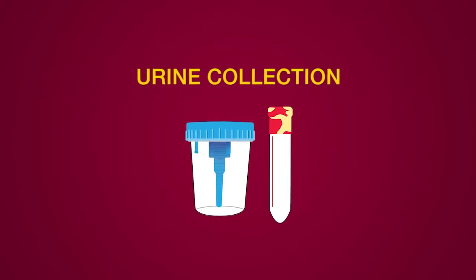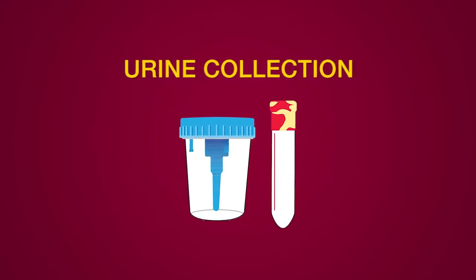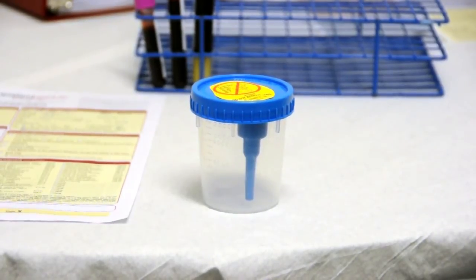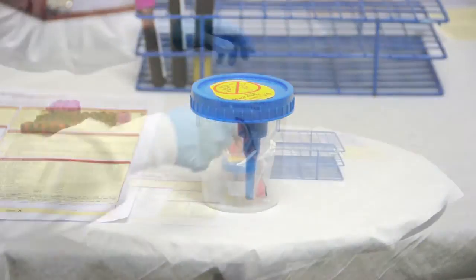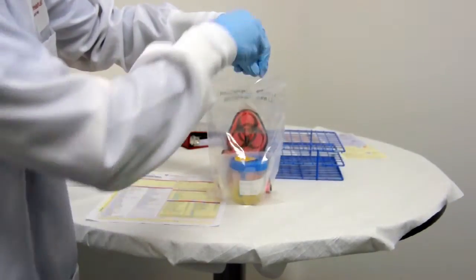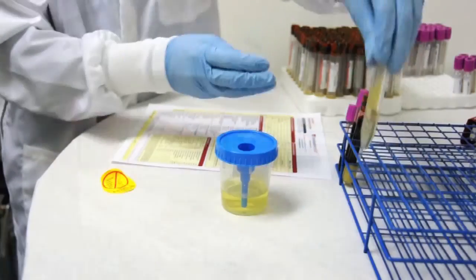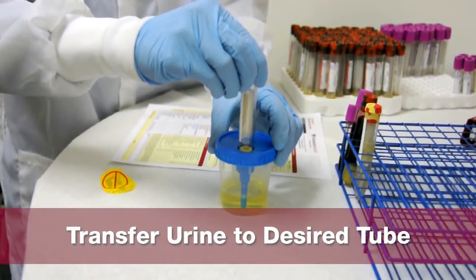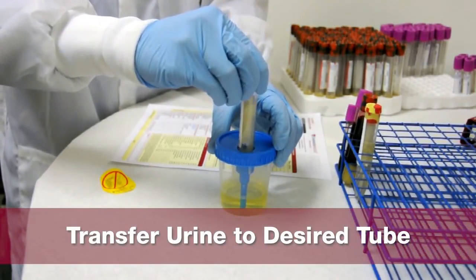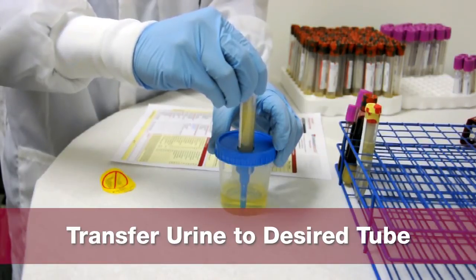Urine collection. Now we will discuss the process for urine collection. Use a blue top urine vacutainer cup. Collect random urine from a patient, peel off the yellow label, invert either the cherry red yellow top test tube or yellow top test tube and place it onto the needle, allowing the urine to transfer into the desired tube.